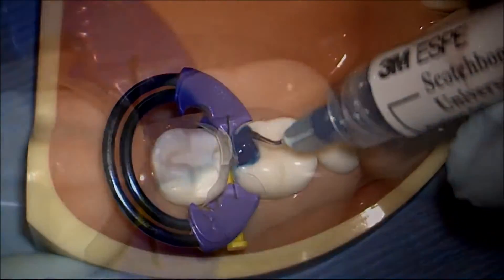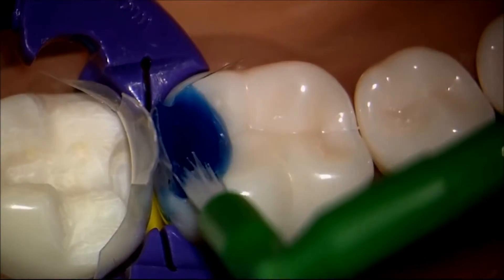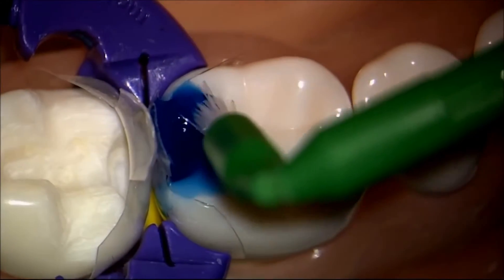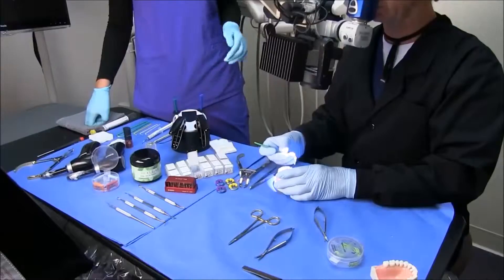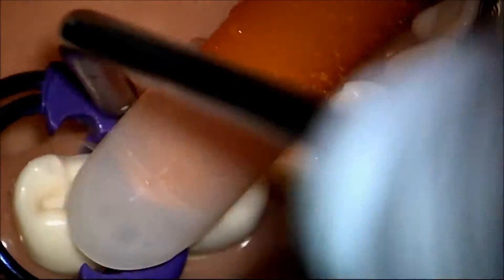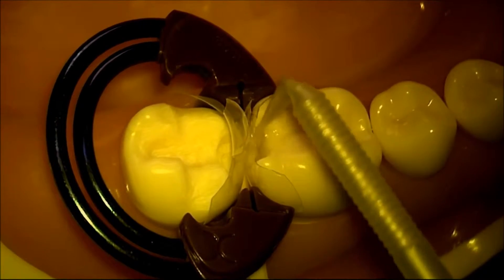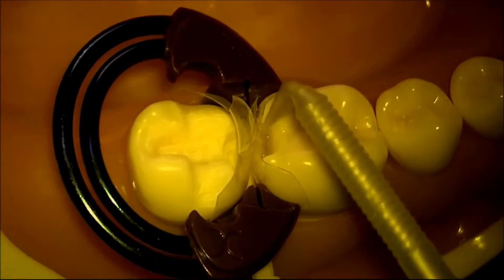You can agitate this just to make sure we've got our infinity edge well etched. We're going to massage the Scotch Bond Universal adhesive into the dentin tubules for a full 20 seconds.